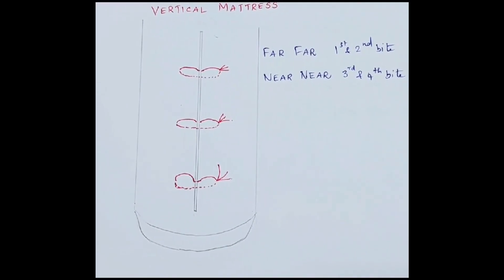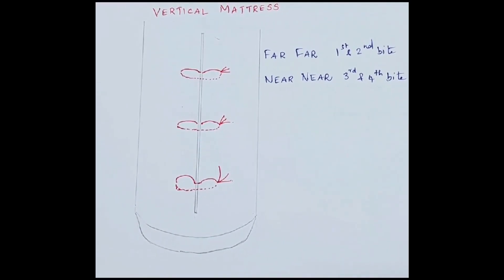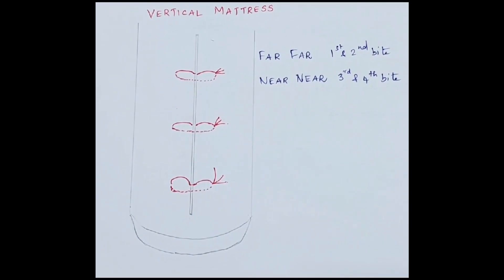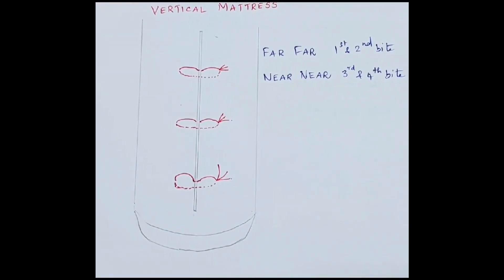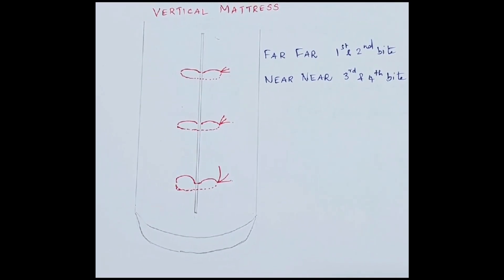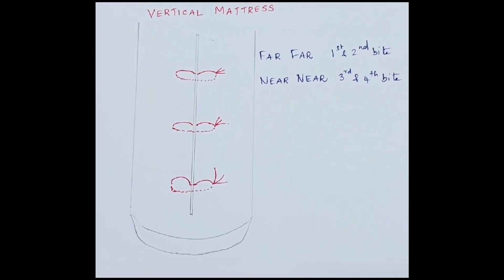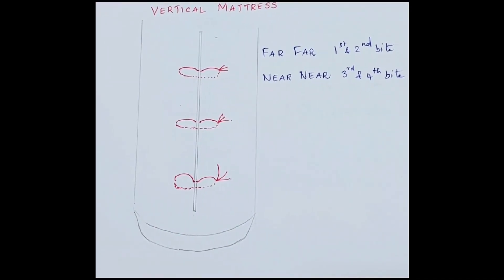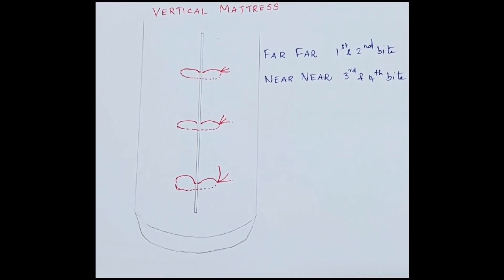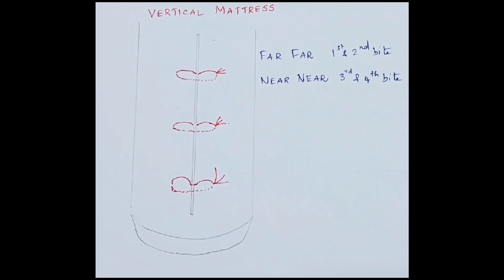Now we are going to see vertical mattress suture. Vertical mattress suture provides perfect approximation of the skin edges and helps in cosmetically acceptable scar. So vertical mattress is used for skin suturing. Vertical mattress suture consists of a far-far and near-near component.